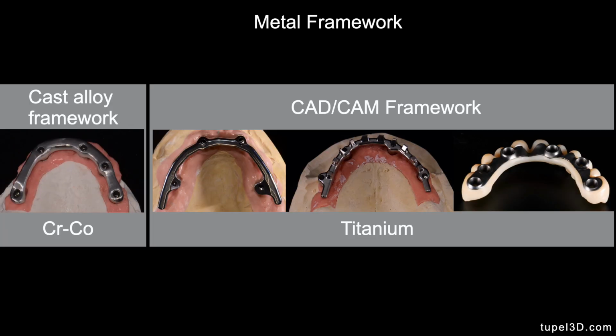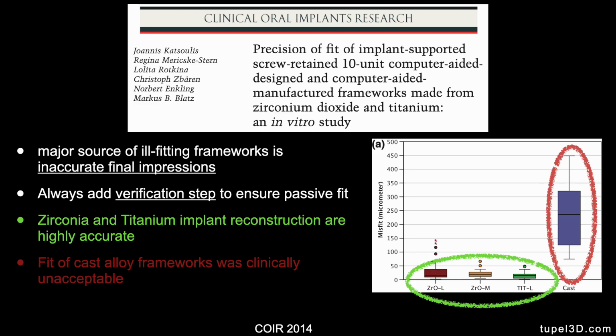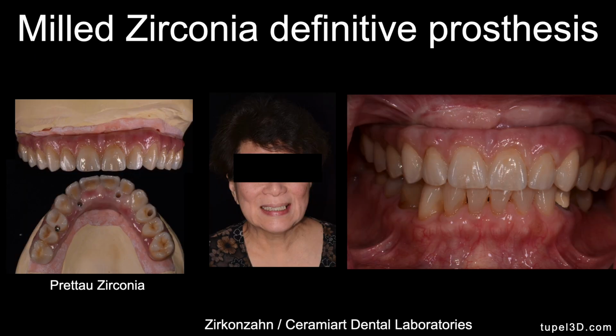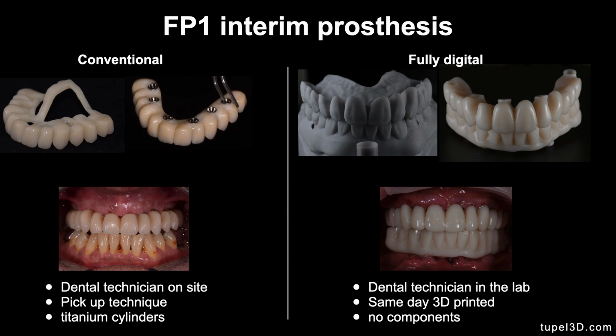There's also been an evolution for the metal framework. Originally we used to do cast alloy framework, and now we have much more sophisticated, advanced CAD/CAM framework in titanium. And we know that the milled titanium bars are much more accurate than the cast alloy. This is the typical FP3 milled final restoration that I usually offer to my patients. We can also have milled FP3 zirconium definitive prosthesis.